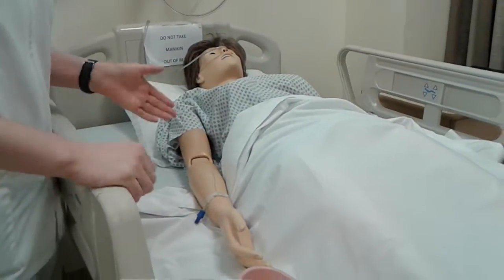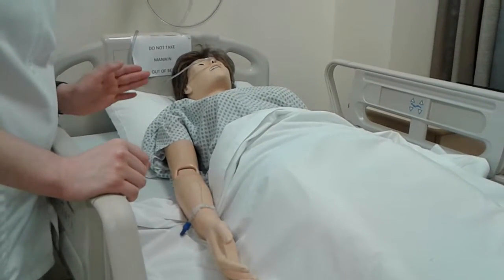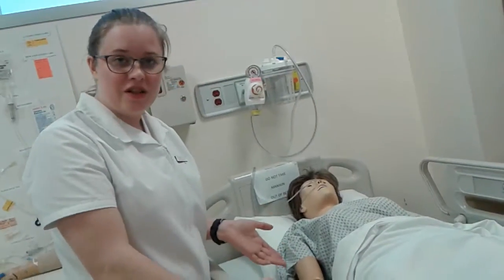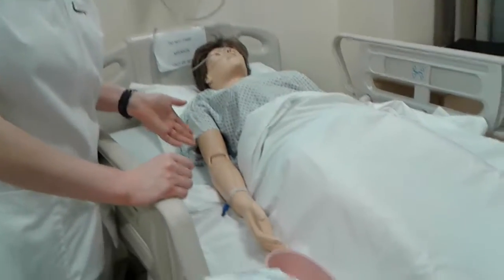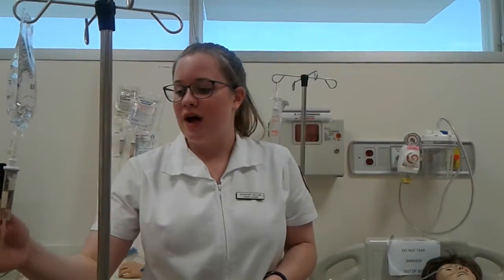I need to check for signs of infection, infiltration, and I need to be looking for signs of redness, swelling, looking for patency in the line, and I would also ask the patient if they're having any pain in or around the IV site. Next, I would be assessing my primary IV and the IV tubing, checking for patency in the line and the rate of infusion that was prescribed by the physician.